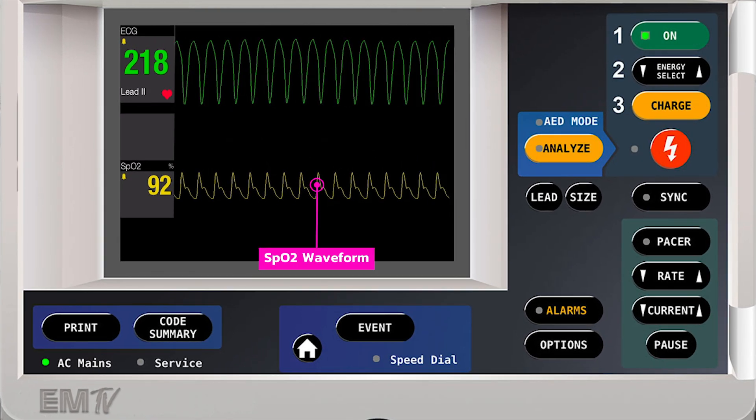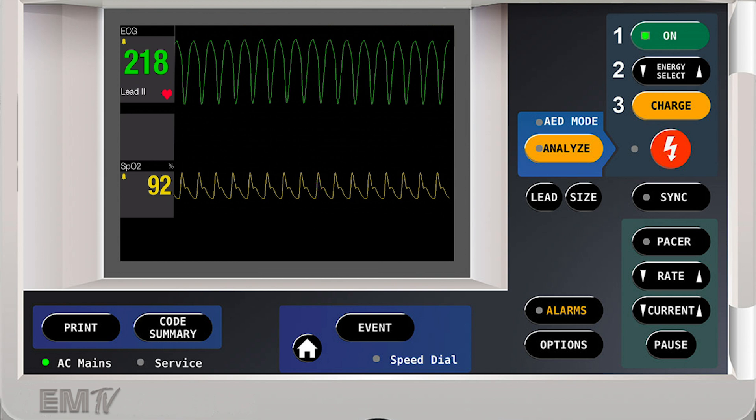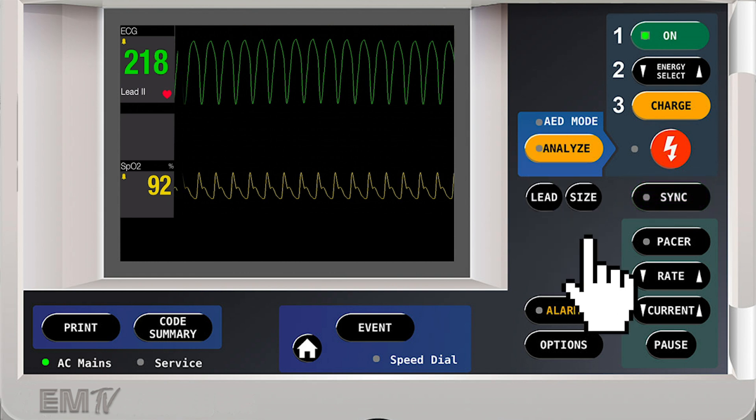Synchronized cardioversion is performed in a very similar fashion to defibrillation on a LifePak 20. However, the sync button must be pressed before every cardioversion attempt.